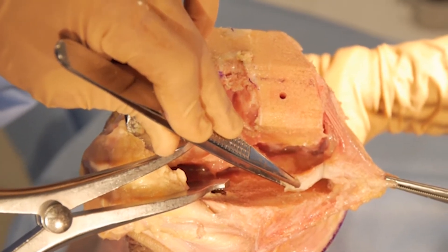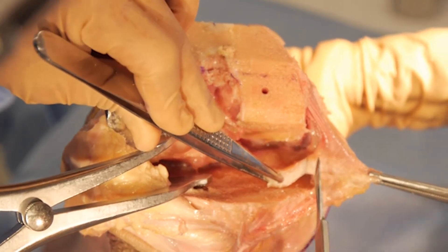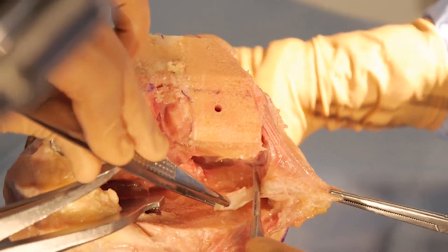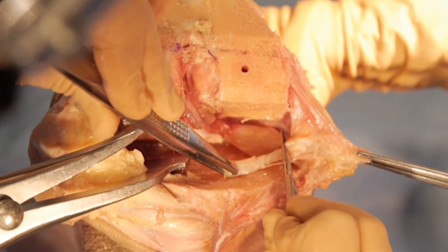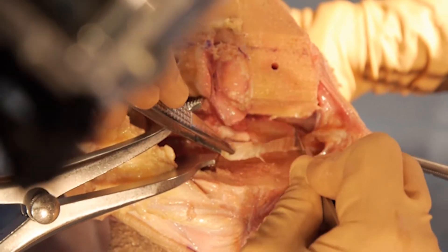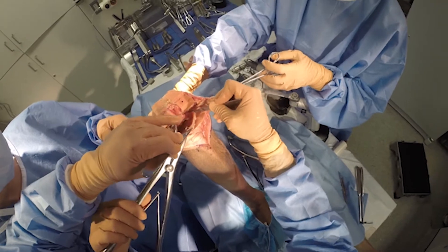Now I'm removing a portion of the medial meniscus. I've got my MCL, I'm looking right at it, and I know where I need to leave a millimeter or two cuff. So as I go around, I'll leave that cuff of medial meniscus right at the area of the MCL, and for the rest of it I can remove the entire medial meniscus.